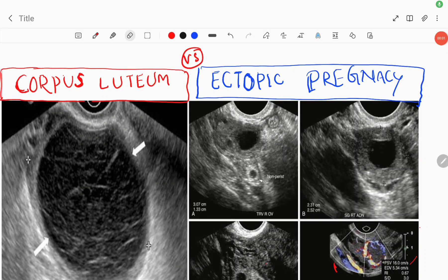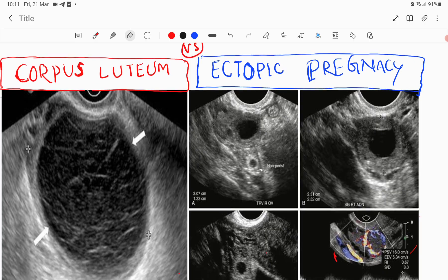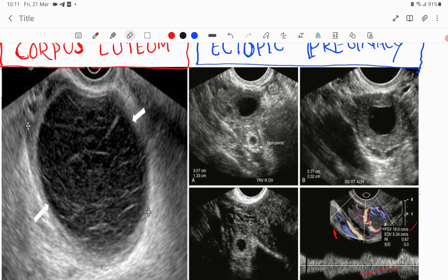Good evening all. Today we will discuss corpus luteum and ectopic pregnancy — how we will differentiate them on ultrasound images. This is a very important topic because questions are asked in physical examinations, and corpus luteum and ectopic pregnancy cause confusion in routine practice due to their similar presentations and similar ultrasound findings.